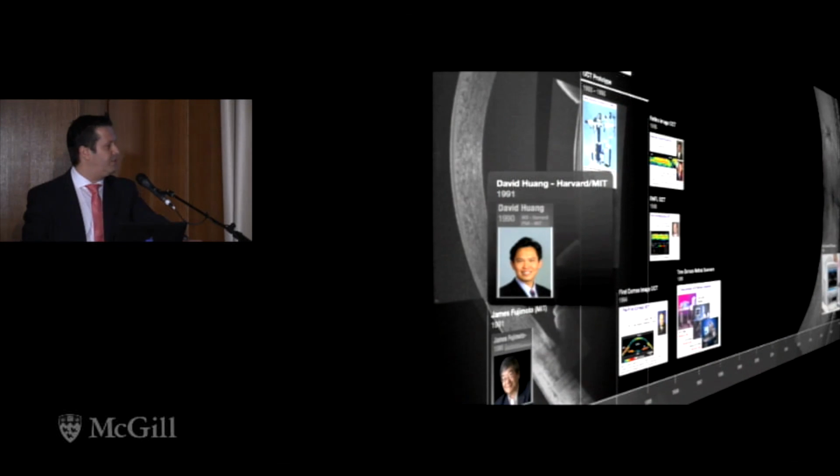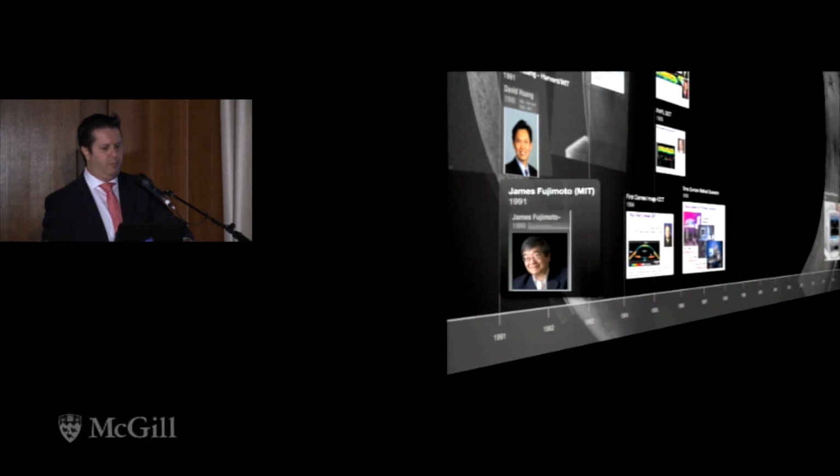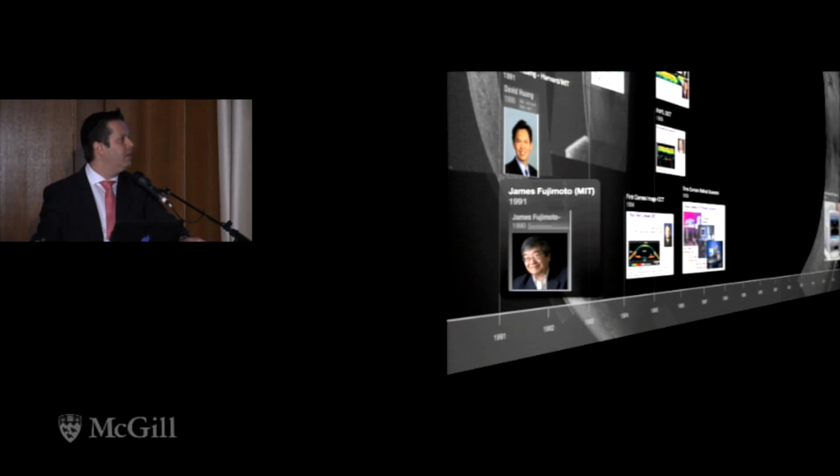OCT was introduced in 1991 by these two men, David Huang and James Fujimoto. And at that time, the idea was to create a technology to measure the thickness of the cornea. So they used a physics principle called low-coherence interferometry, and that technology was able to image the retina and cornea, retinal nerve fiber layer, and so on.